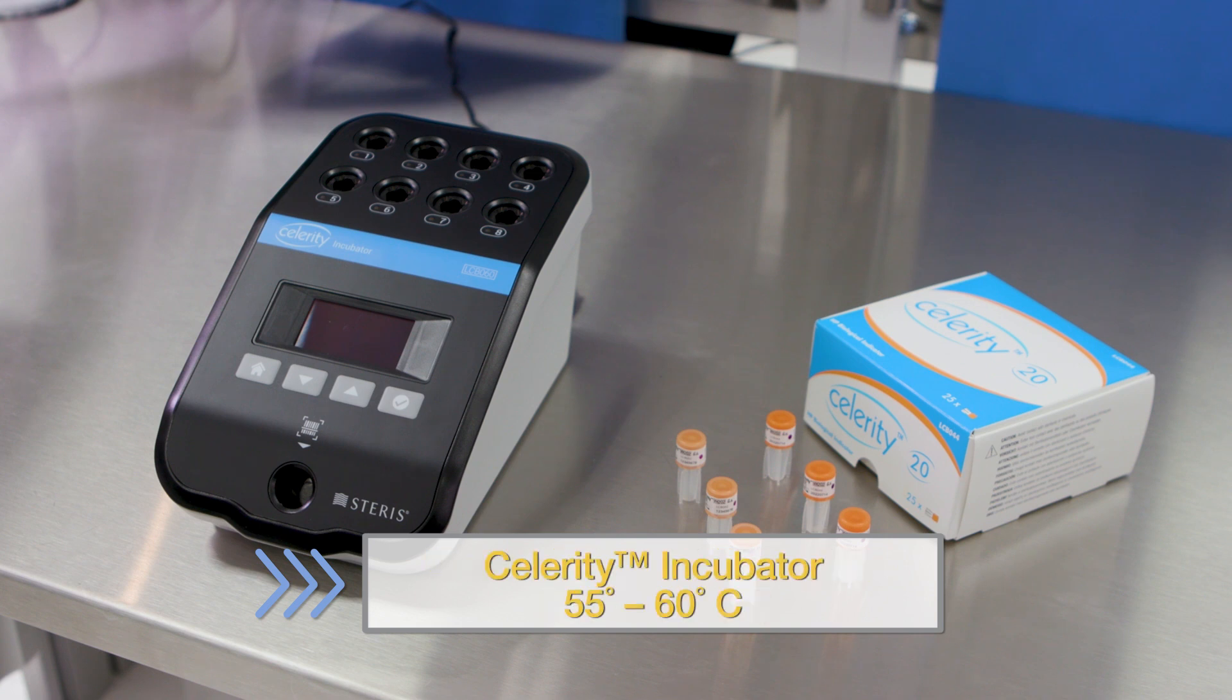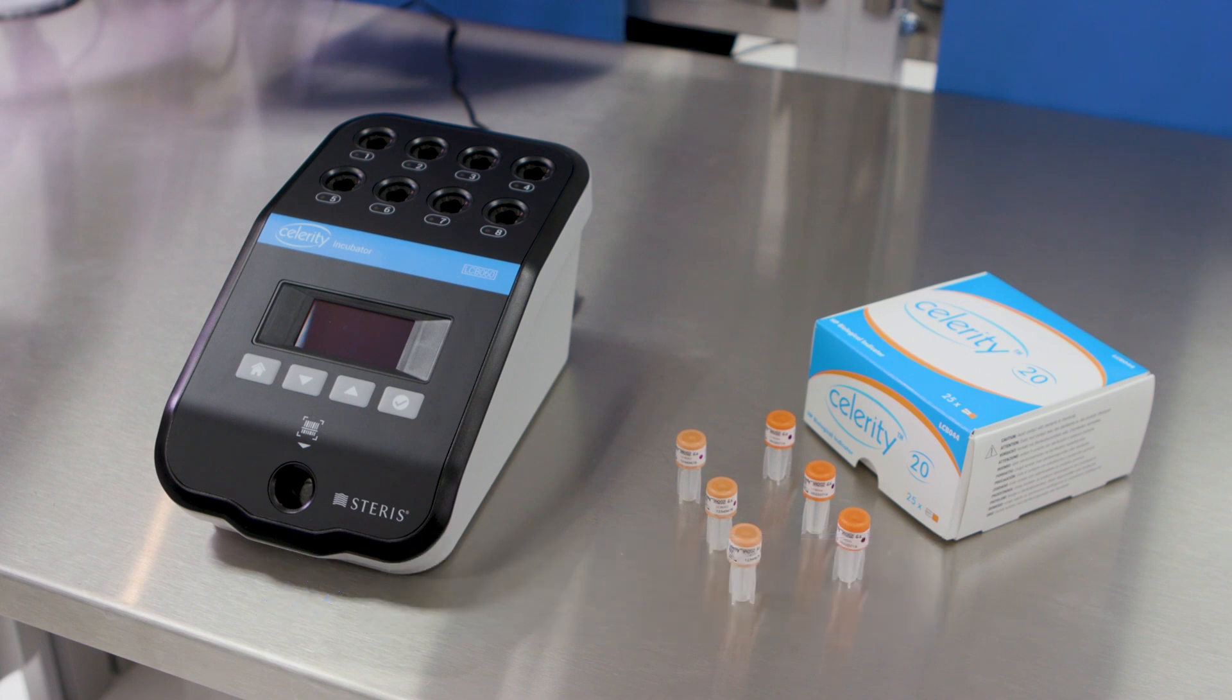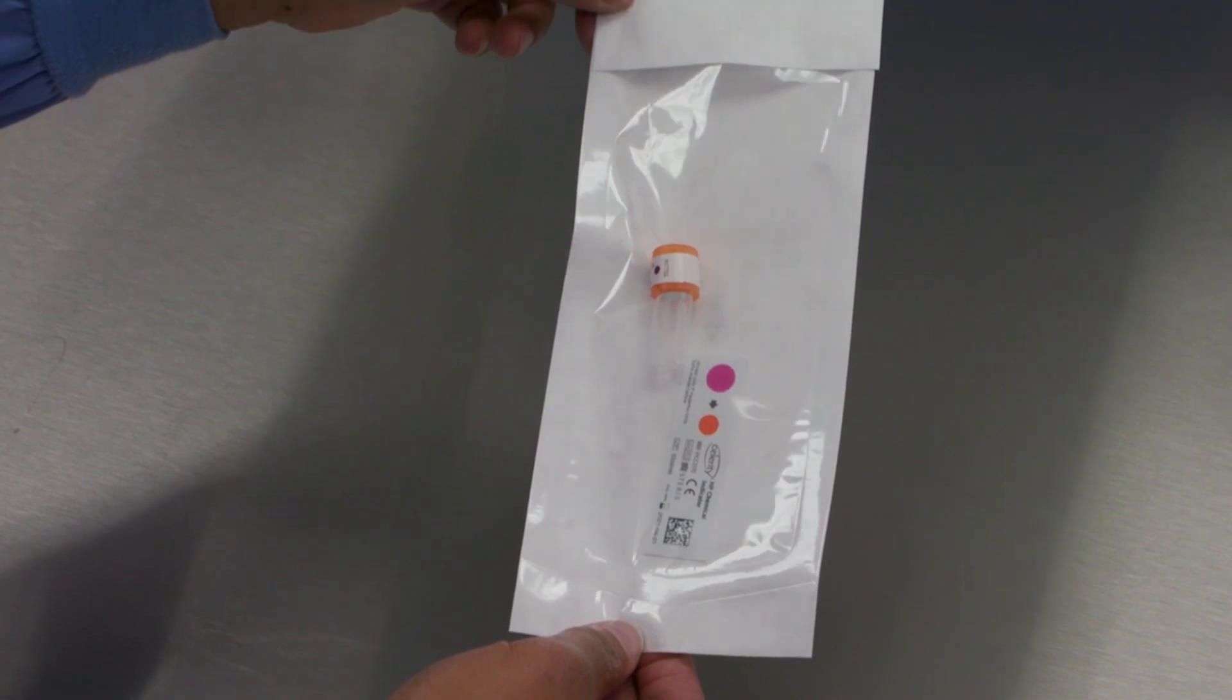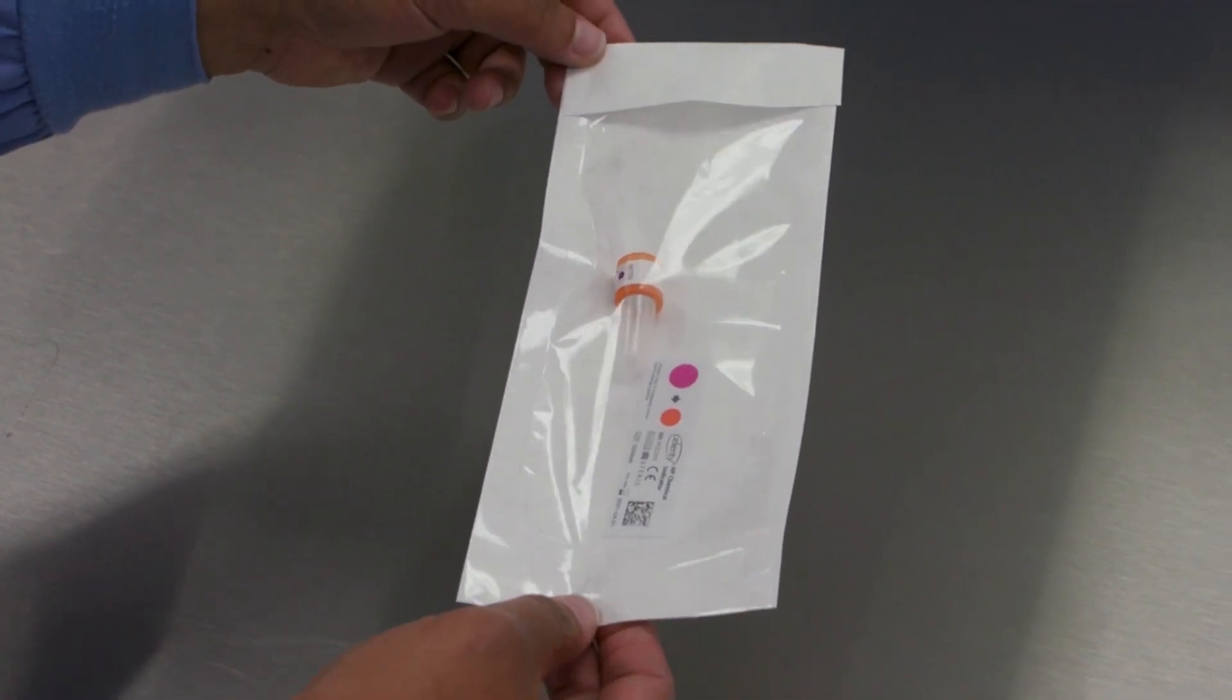Celerity incubator set at 55 to 60 degrees Celsius and warmed up for 30 minutes to incubate and read the results. Chemical indicators intended for use in VPRO or STERAD sterilizers. Appropriately sized pouch intended for use in VPRO or STERAD sterilizers.